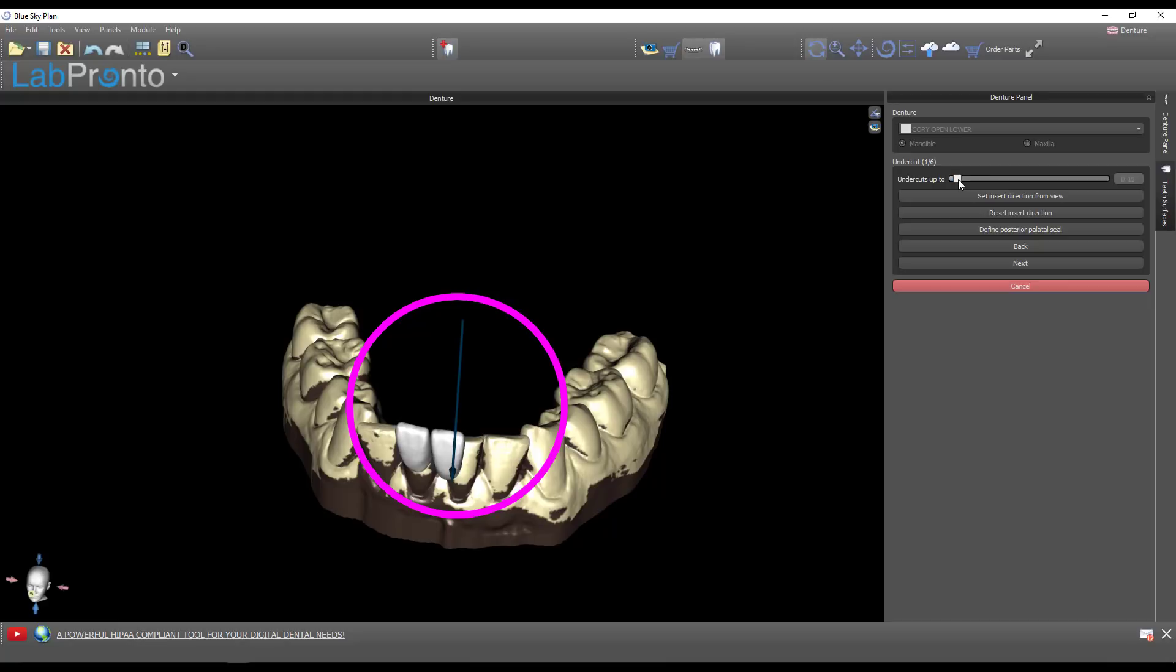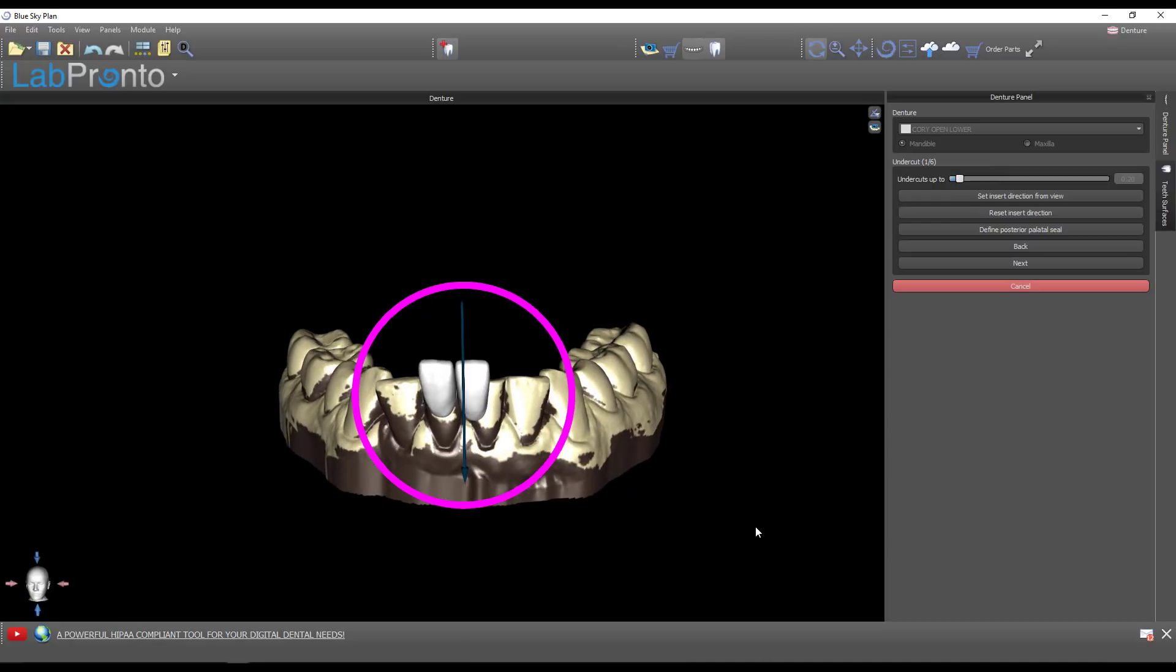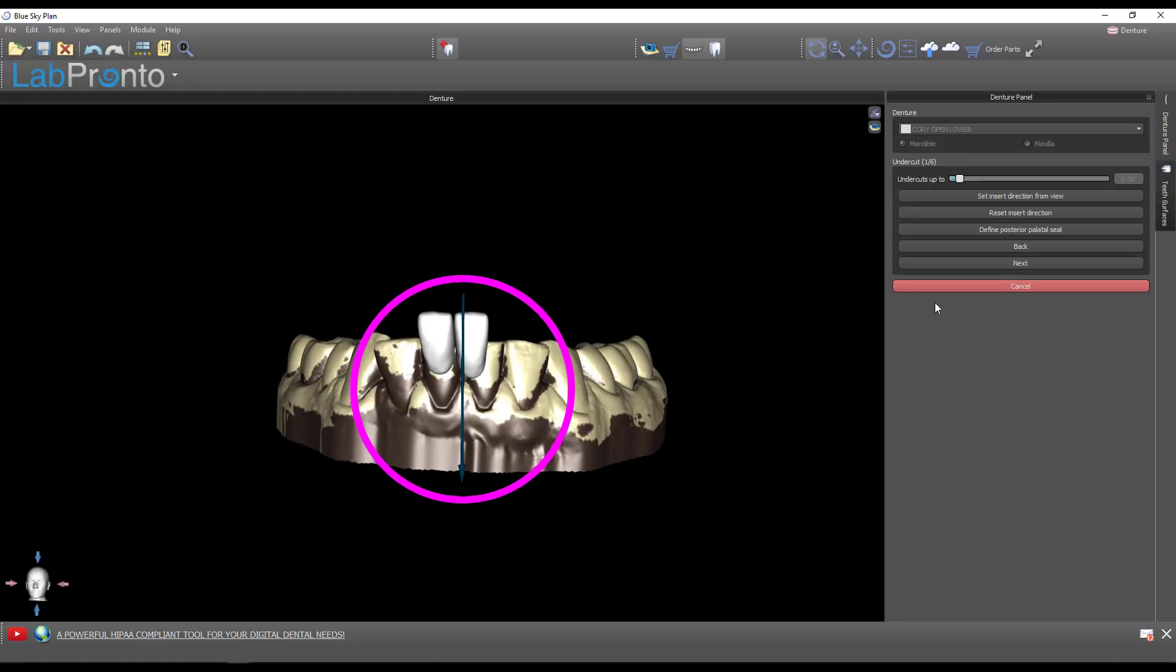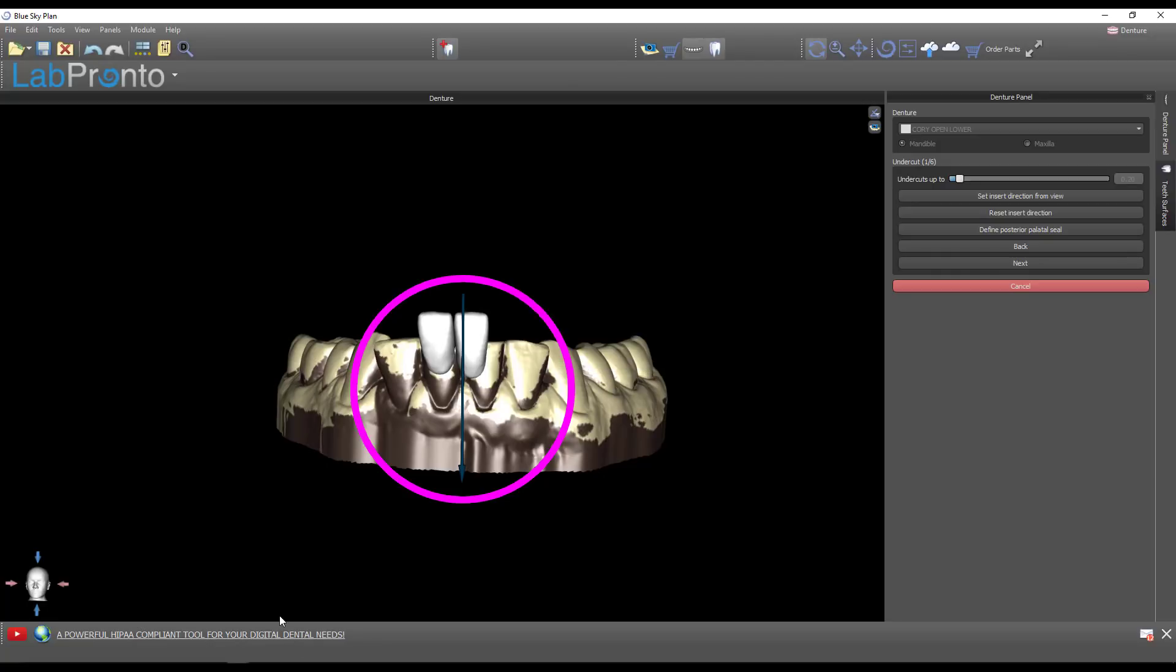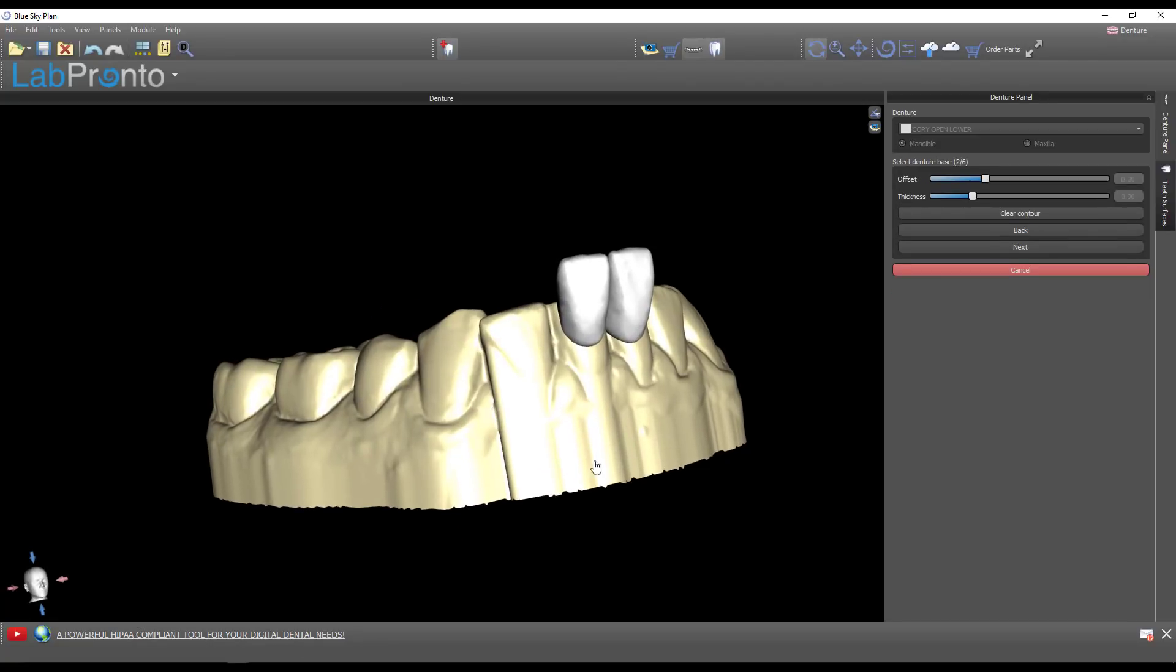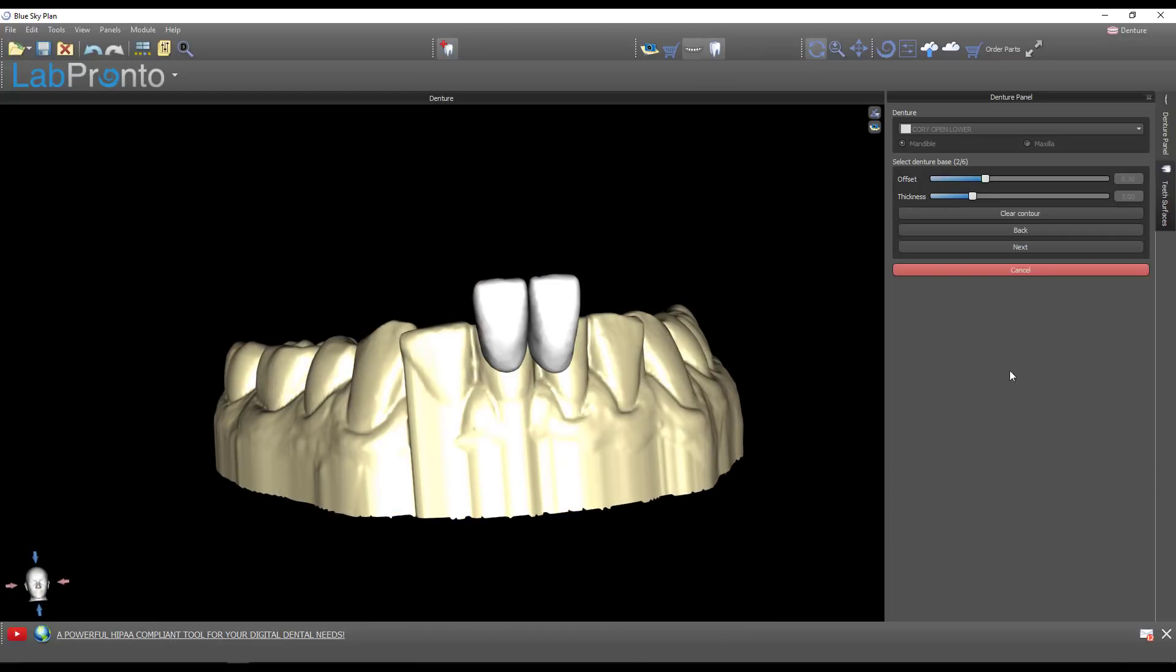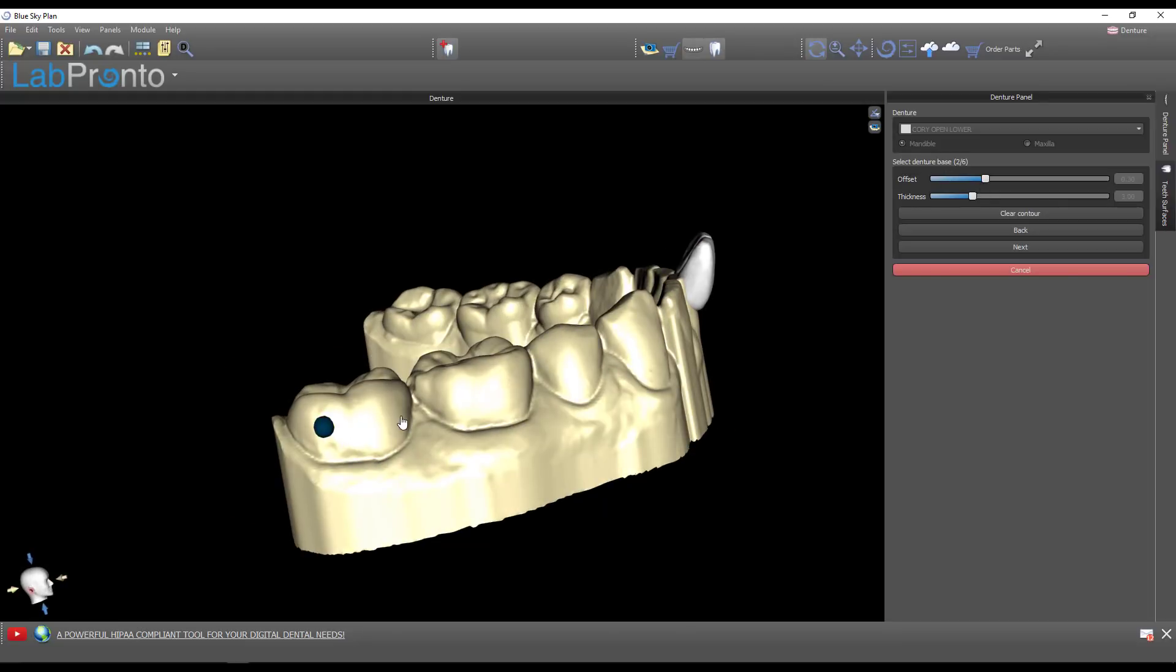Do you want to allow undercuts or not? We do not want to allow undercuts - we want to block those out. But I do find if you allow undercuts up to about 0.2, that will create a little bit of a snap fit where this thing will have some retention. Go to next and now a new model has been created blocking out those undercuts. This is a huge feature.